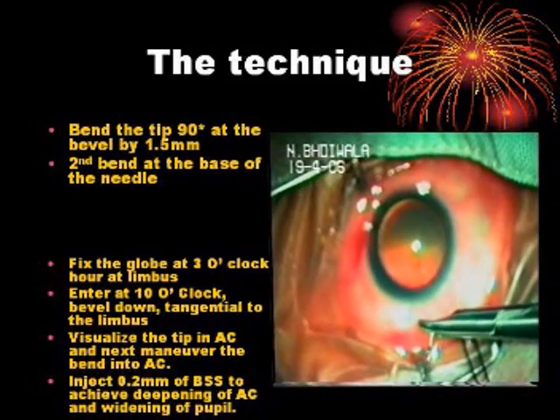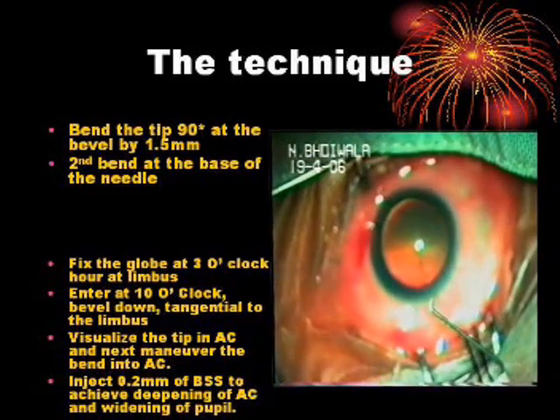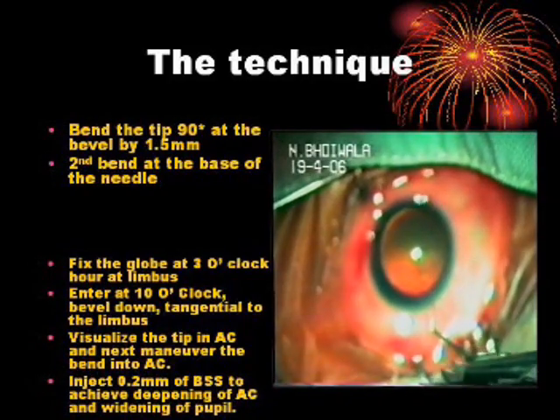The technique: Bend the tip 90 degrees at the bevel by 1.5 millimeters, then make a second bend at the base of the needle.